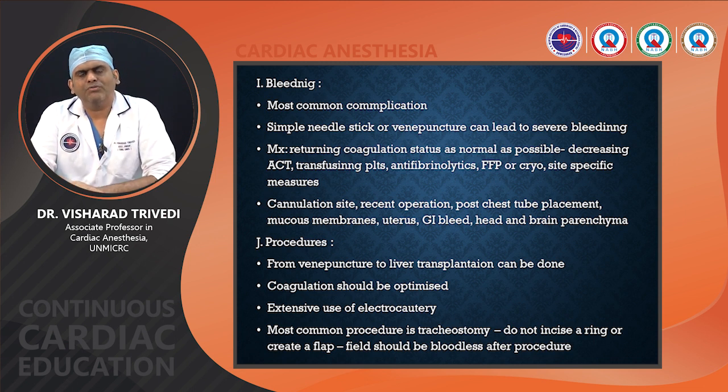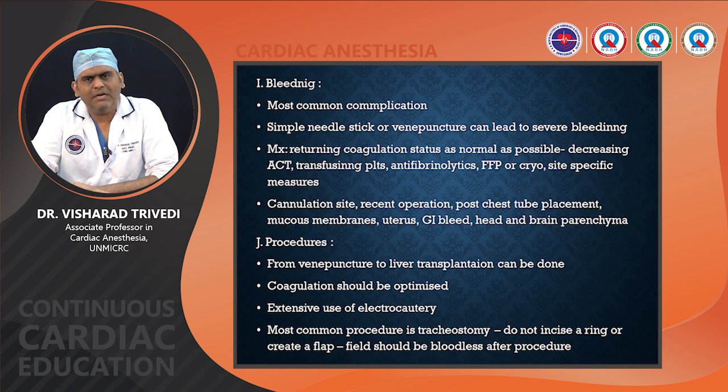If you want to do any procedures on Veno Venous ECMO, the most common procedure to be done on Veno Venous ECMO is tracheostomy itself.